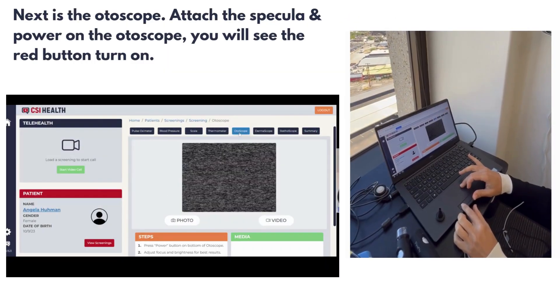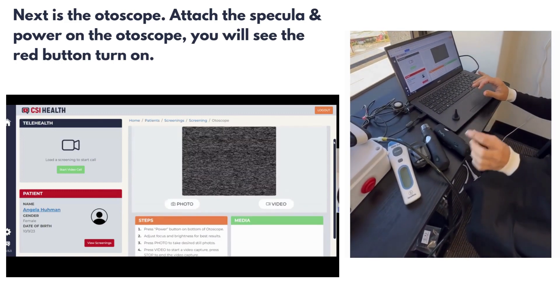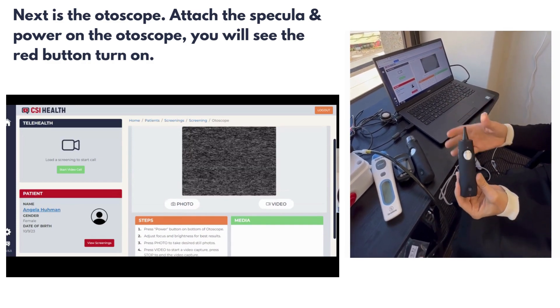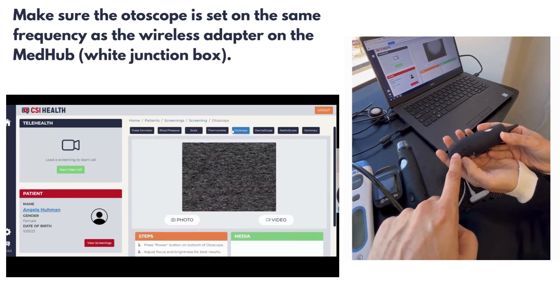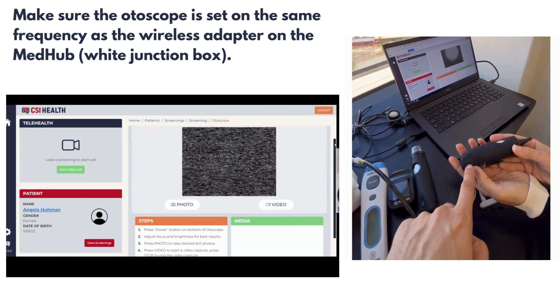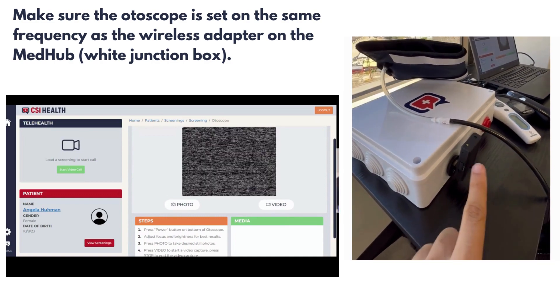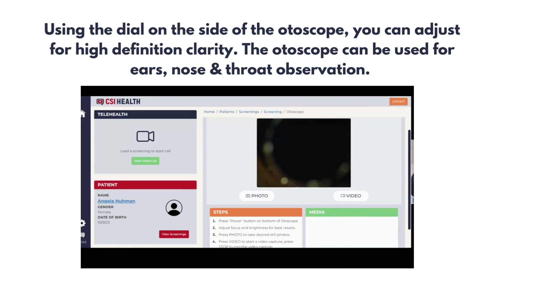Next is the autoscope option. Attach the specula and power the autoscope on — you will see a red button. It is important to make sure to turn off each wireless device when not in use. Please do not have more than one wireless device turned on at the same time. Make sure the autoscope is set on the same frequency as the wireless adapter on the MedHub or the white junction box. Using the dial on the side of the autoscope, you can adjust for high definition clarity.